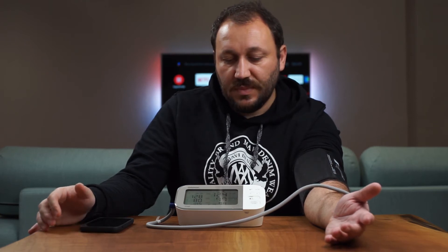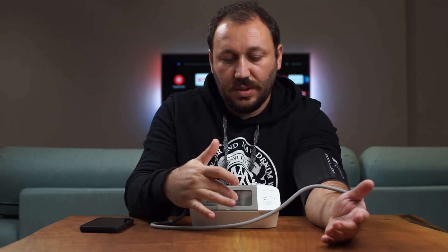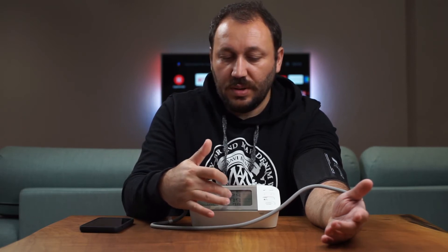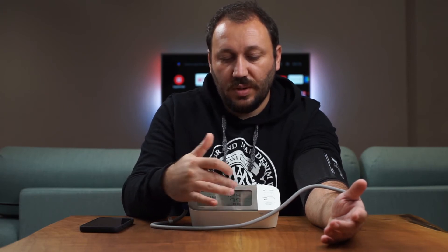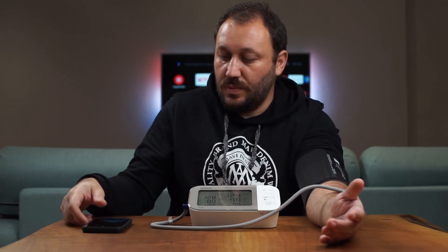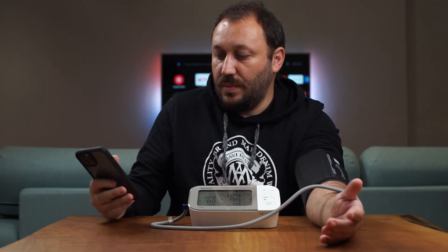The measurement is done. My pulse was 79, and there's a small number of 77. The high number — the systolic — is 124. Previously it was a little bit higher and now it's a little bit lower. Let me open the app to show you the sync.